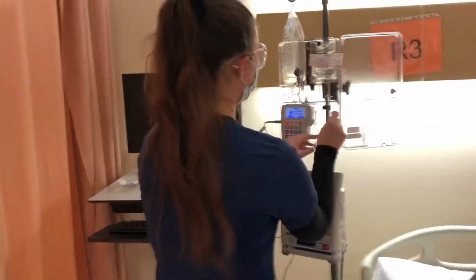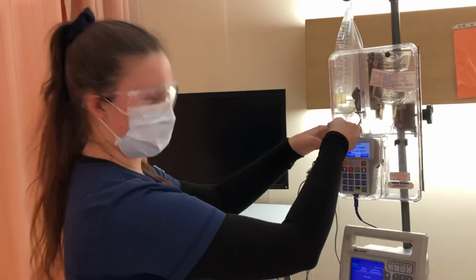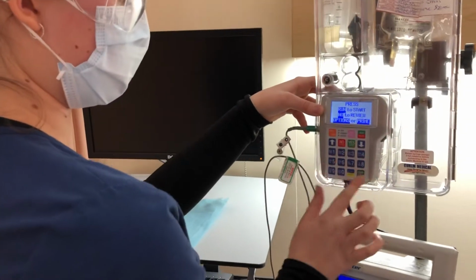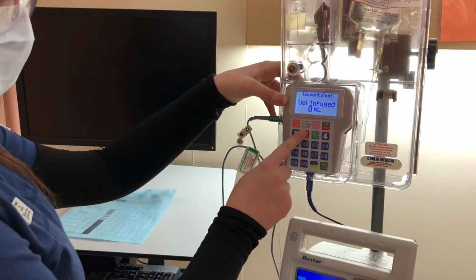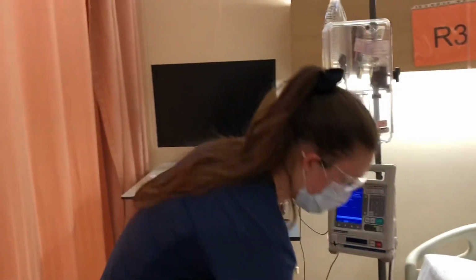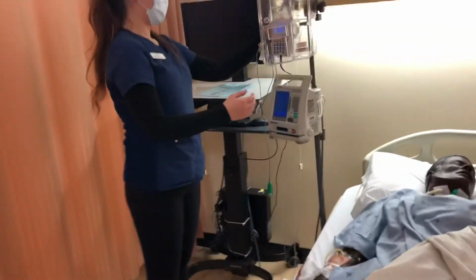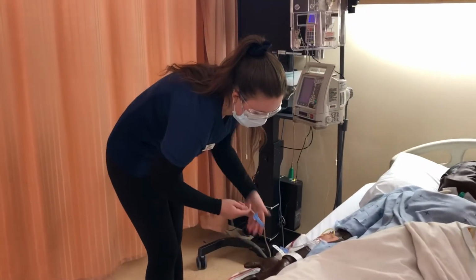So this is hanging. So I will close it and lock it. And I'm now going to press run because the second nurse has verified that everything is correct. I'm looking for a green flashing light, which I am seeing, so I know that this is ready to go. I'm going to follow the tubing all the way down to the patient to make sure that all of the clamps are open. And they are, so again, I can follow the TKVO infusion tubing all the way to the patient to make sure those clamps are open.